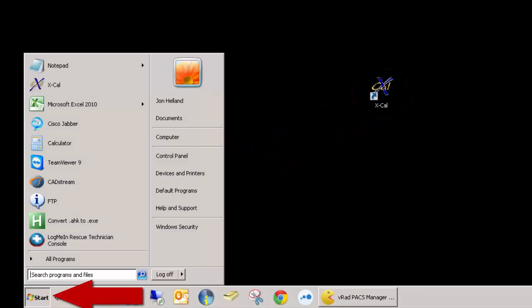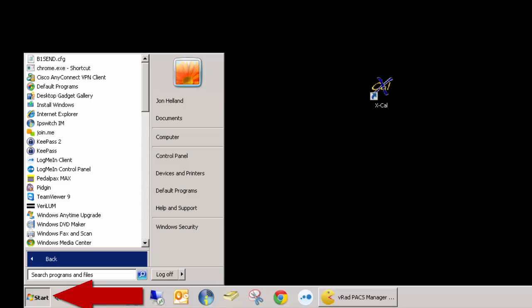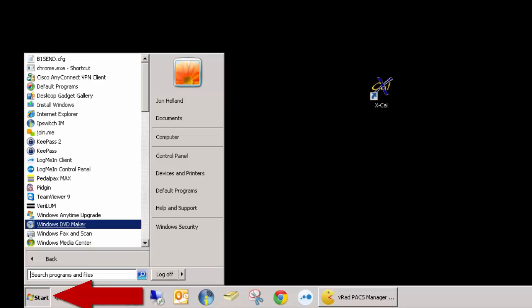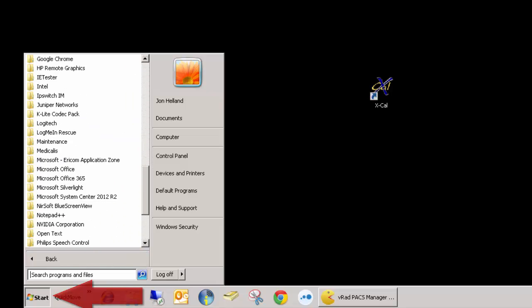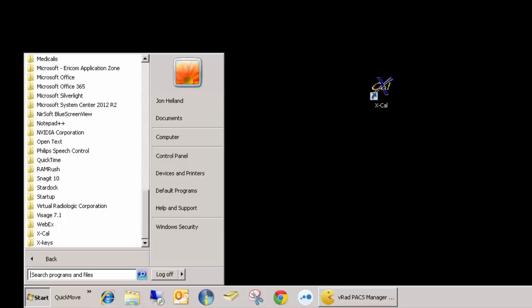You can open XCal by using the shortcut on your desktop. If you do not have a desktop shortcut, you can navigate through the Start menu to locate and execute the shortcut.